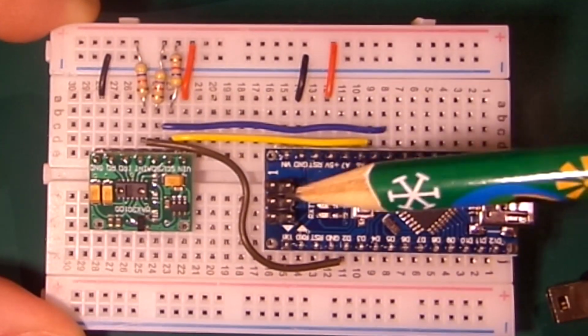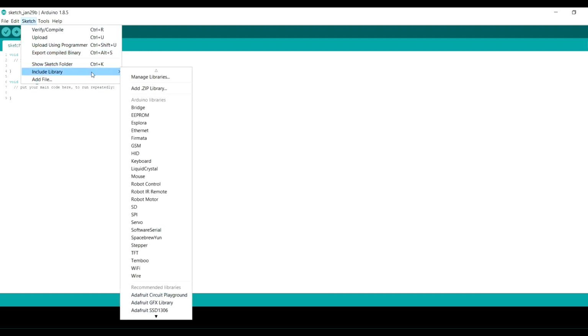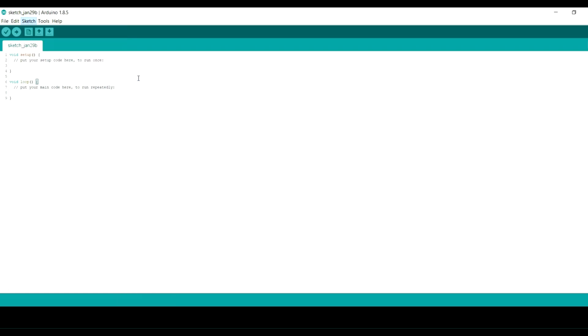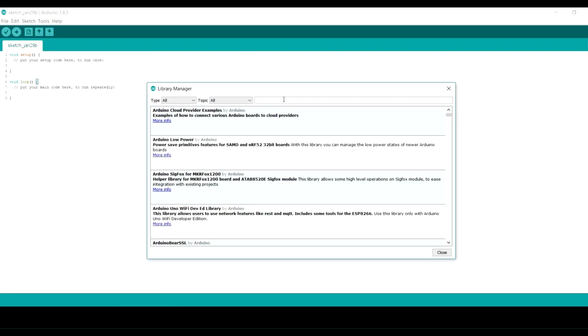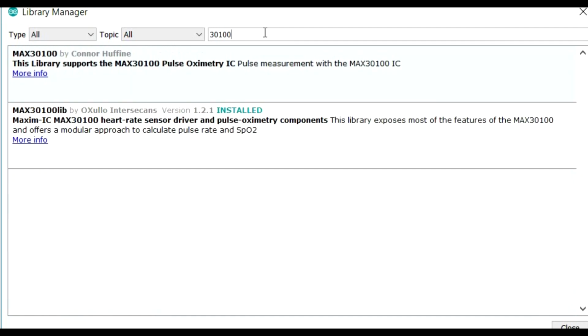So let's have a look at what you need to drive this, and we'll look at the default examples that come with it. So to load up the libraries for this actual device, go to Sketch, Include Library and Manage Libraries, and then if you go into Filter Your Search, type in 30100 and you get two libraries up. This one at the top is by SparkFun. Couldn't get that one to work.